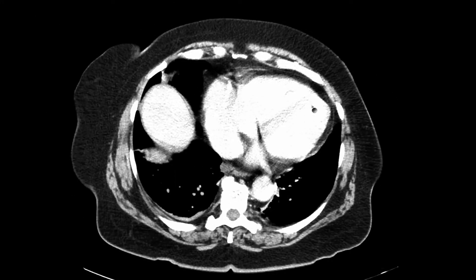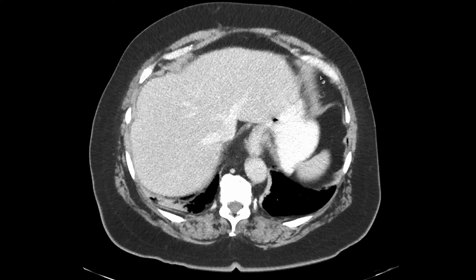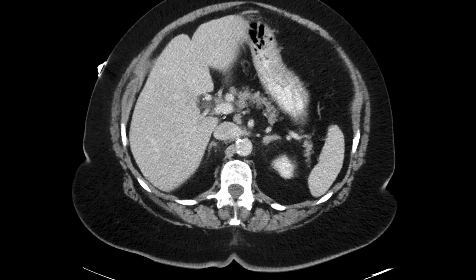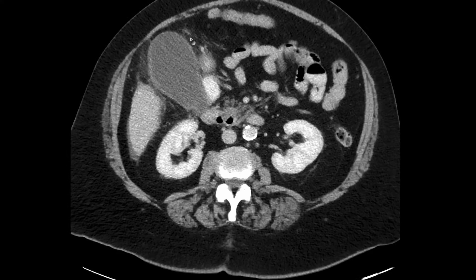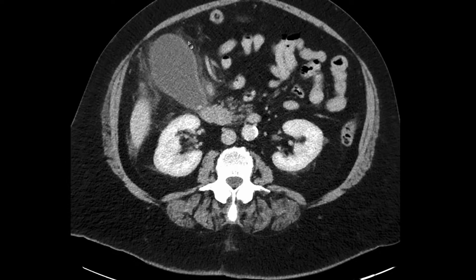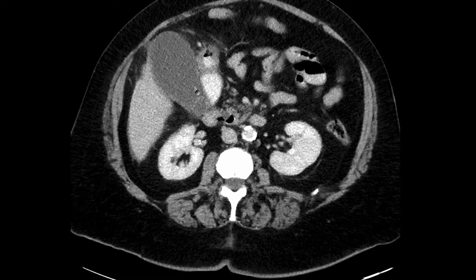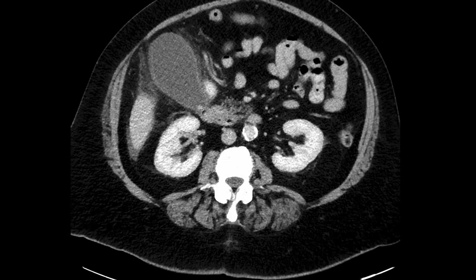Moving to the next case: this is a contrast-enhanced CT in the axial plane in a different patient, an 83-year-old. As we scroll down looking for the gallbladder, we can immediately see that this gallbladder is markedly more distended than the previous case. The gallbladder wall is thickened. The surrounding fat is fuzzy, which indicates stranding. Looking within the gallbladder, we can see in the proximal gallbladder a small ovoid hyperdense structure, which is a gallstone.